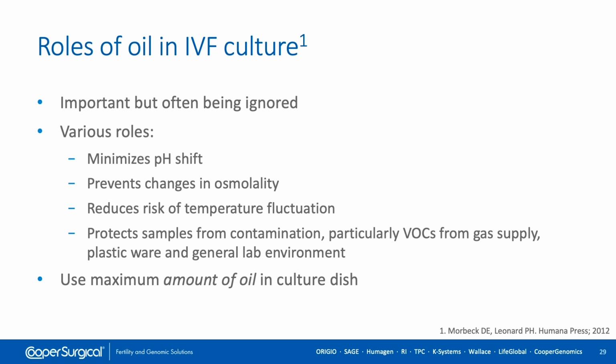And we don't have time to talk about air quality today. It's a whole other area where we potentially could talk about, but for the moment, we've been looking at pH, osmolality and temperature. And as said previously, we should use the maximum amount of oil in our culture dishes as we can without running the risk of oil sealing the lids and gaseous exchange.